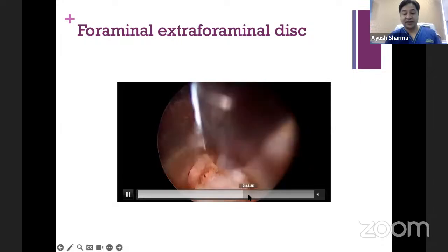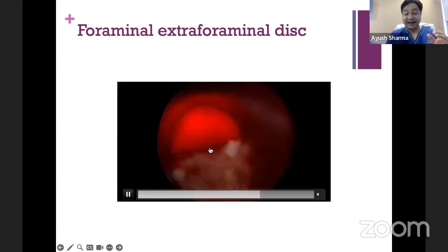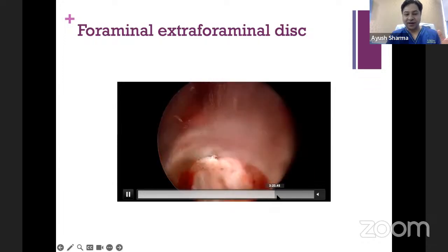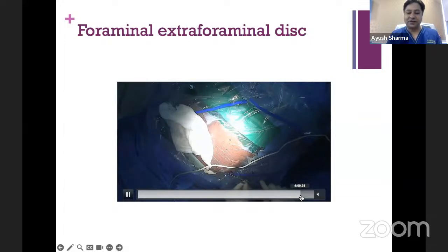In this case, you will see as we go ahead, the root was very thick, edematous, and angry looking, which is how you normally see it. You make sure that you remove everything, and then you complete the job.